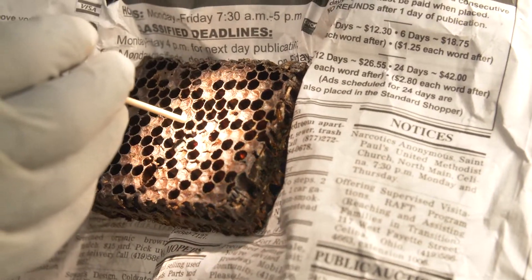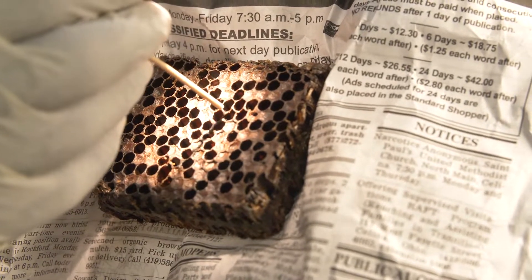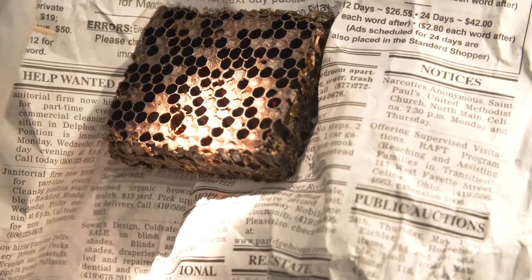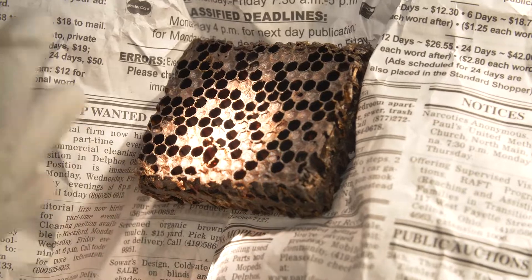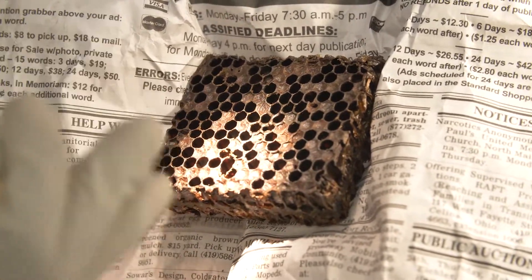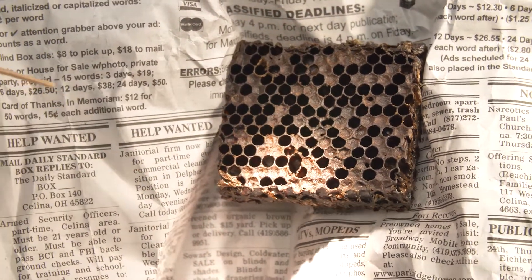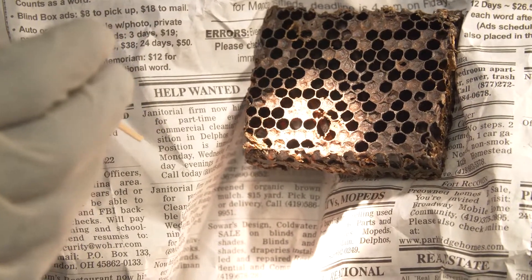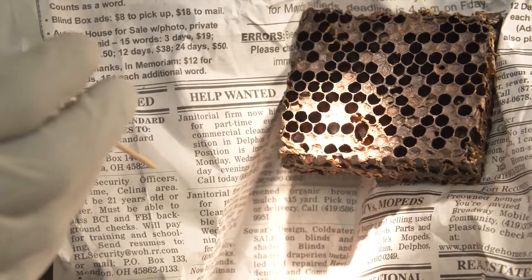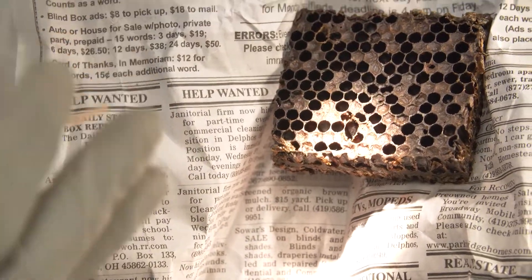In this case, I'm finding some dead larvae that have formed into scale. By scale, I mean the bacteria have consumed all the brood and it has dried down and fixed onto the cell wall. So the bacteria consume the whole larvae or pupa, and the remaining material dries out and gets stuck in the wall — that's the sign that something happened and that a bacteria is present.